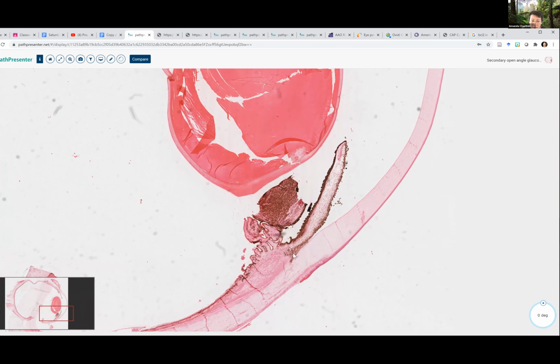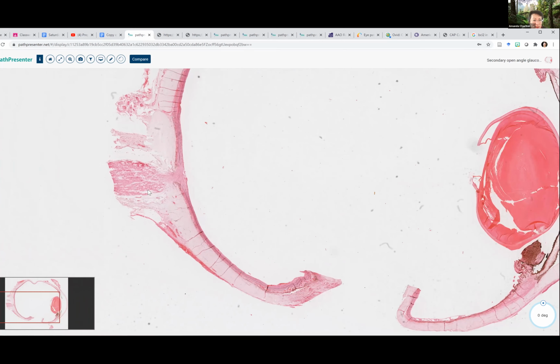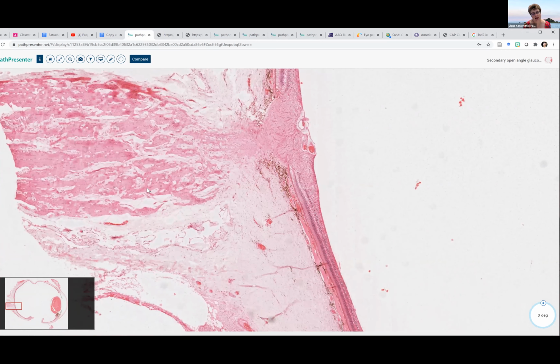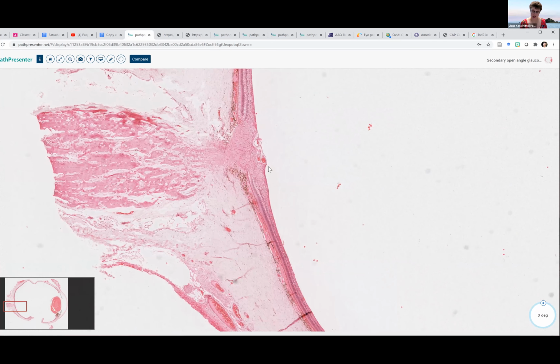What should we add to that, Diane? If we're calling it a glaucoma, we should look to the back of the eye. Yes, we need to find evidence of it. It's not the best section of optic nerve, I must say. However, if it's an acute melanomalytic glaucoma, we wouldn't get the chronic changes in the posterior, because it might cause a more acute glaucoma, but it's definitely always worth commenting on it. Yes, I don't see a cup here.